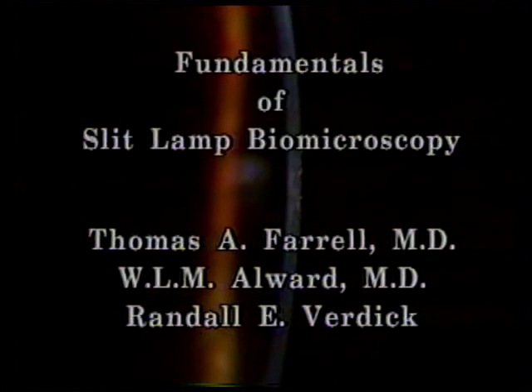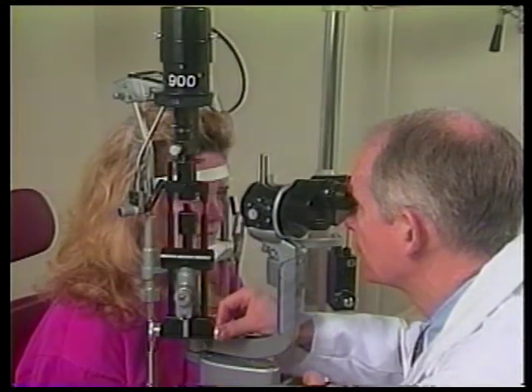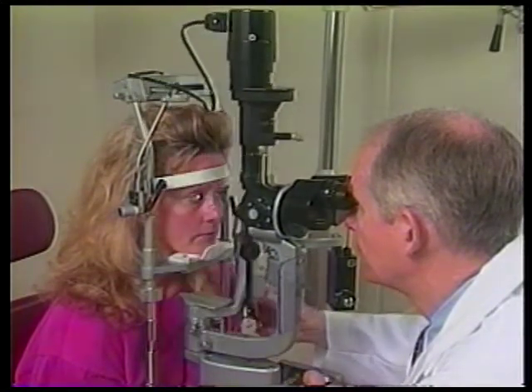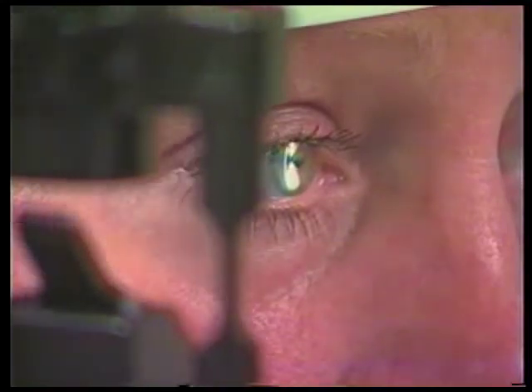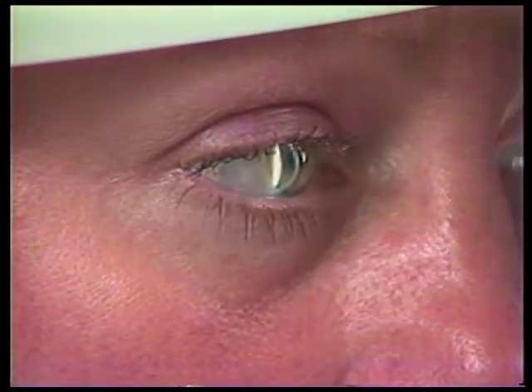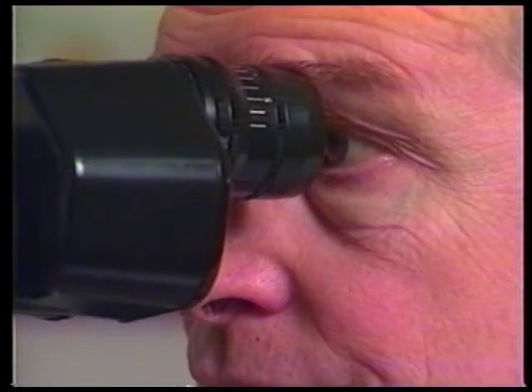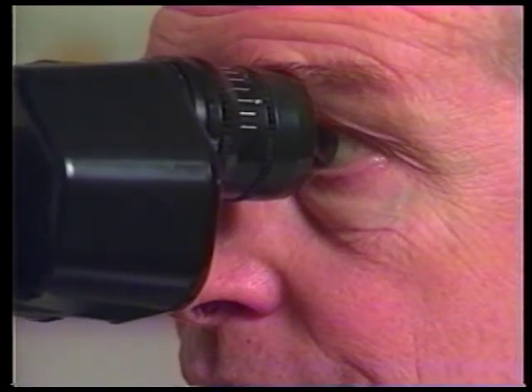Slit lamp biomicroscopy is an acquired skill. This introduction will help you over the initial hurdles that all face when confronted with our first patient at the slit lamp. The purpose of this video is to acquaint you with all the features and uses of slit lamp biomicroscopy. With this information, you can begin concentrating on what you're seeing rather than thinking about the mechanics of the examination. As Yogi Berra says, you can see a lot just by observing.